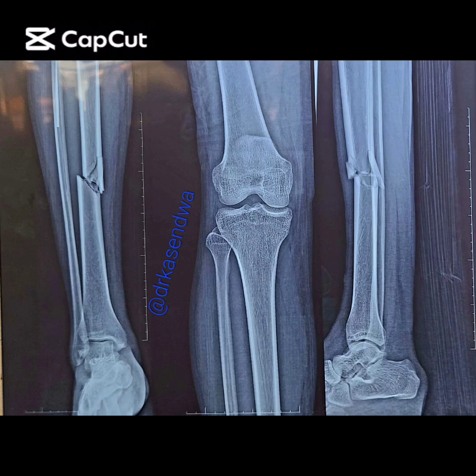This is a 25-year-old female who had a road traffic accident one day ago and sustained this closed fracture of the mid tibia, as you can well appreciate in these x-rays. So we have three pictures before us. On the left is the AP view, in the middle is the knee joint, and on the right is the lateral view of the tibia and the fibula.